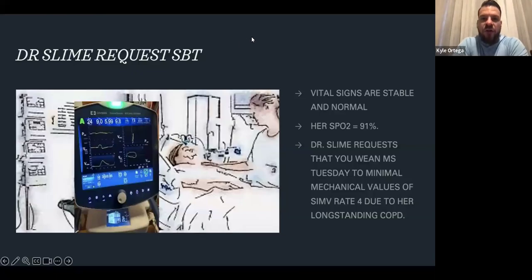All right, I am recording. This is the third video in our series of video six assignment. In this video, Dr. Slime has requested an SBT, so go through all the things dealing with that.